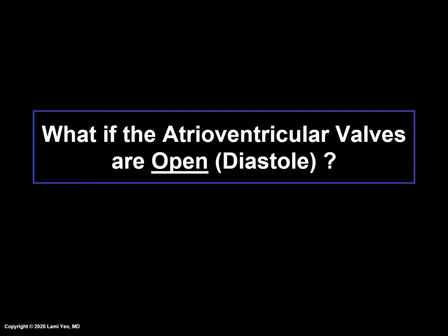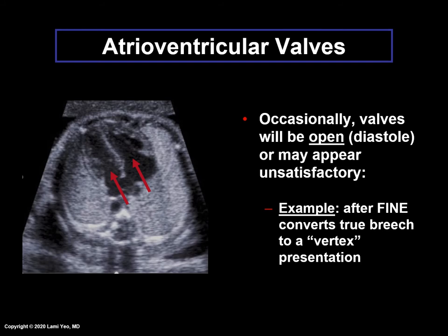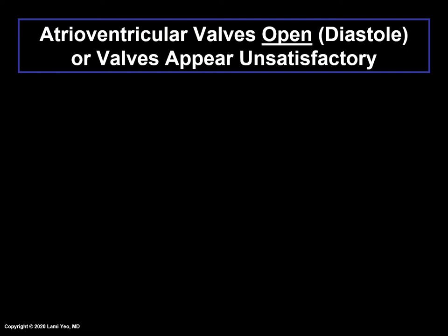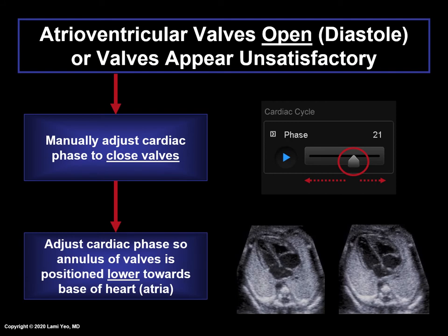Occasionally the valves will be open in diastole or appear unsatisfactory — for example, after FINE converts a true breech to a vertex presentation. The atrioventricular valves can be manually closed by adjusting the gray slider button. The cardiac phase should be adjusted so that the annulus of the valves is positioned lower towards the base of the heart, or atria. Remember, most of the time FINE will automatically close the atrioventricular valves so you don't have to manually do this.